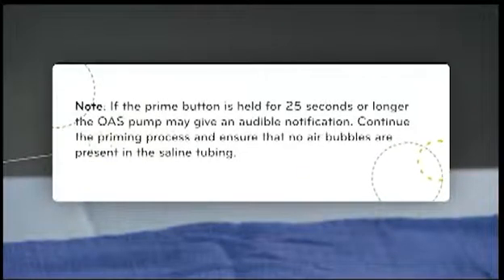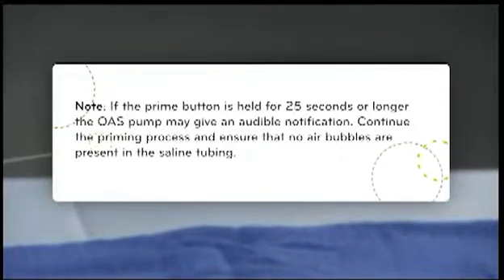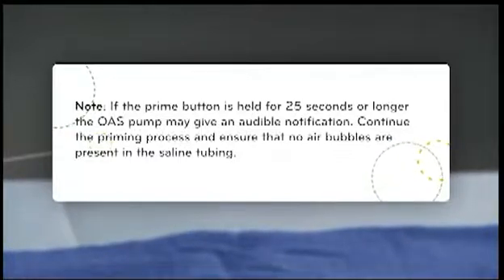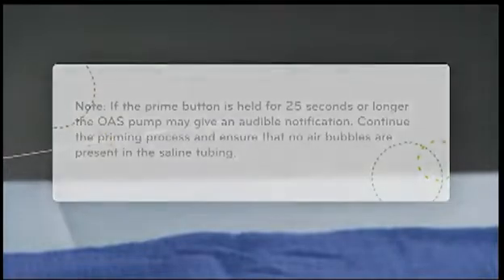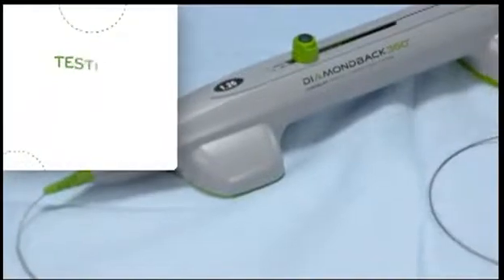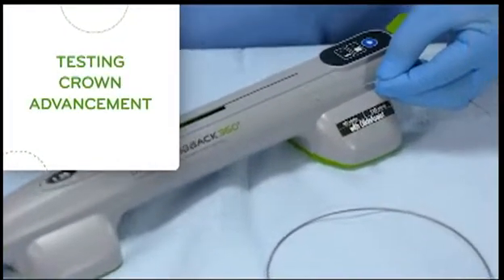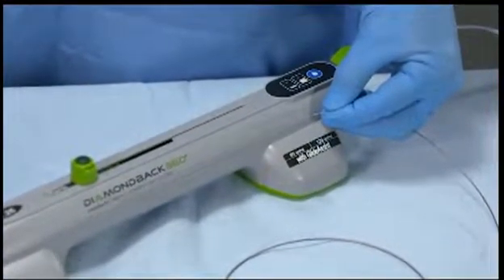Note: if the prime button is held for 25 seconds or longer, the OAS pump may give an audible notification. Continue the priming process and ensure that no air bubbles are present in the saline tubing. Watch for saline to exit from the sheath near the crown and ensure that no air bubbles are present in the saline tubing. Before inserting any portion of the OAD into the body, ensure that axial movement of the crown advancer knob will produce smooth travel of the crown.